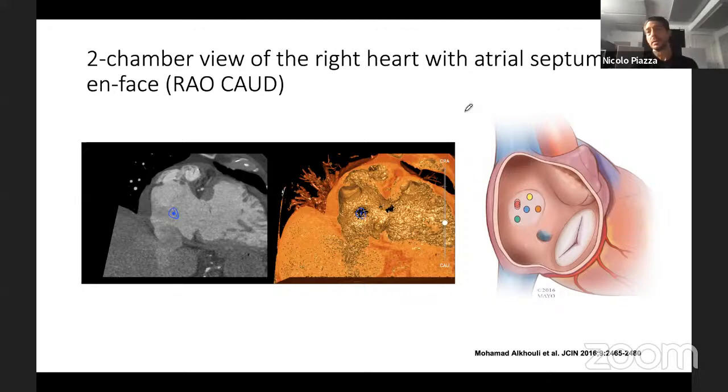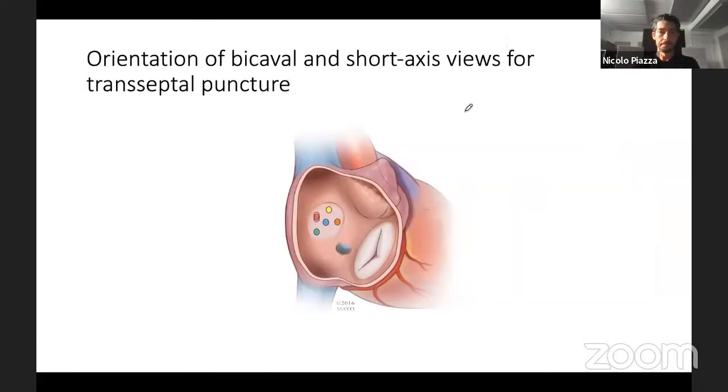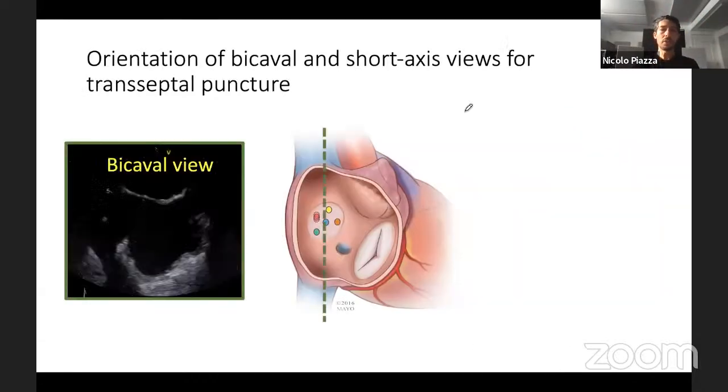The blue dot is something maybe you might want to do for a transseptal mitral valve replacement with a large bore catheter because you don't want to injure the rims of the heart. And so when you talk about a bicaval view, then what you're doing is you're transecting the SVC all the way down to the IVC.